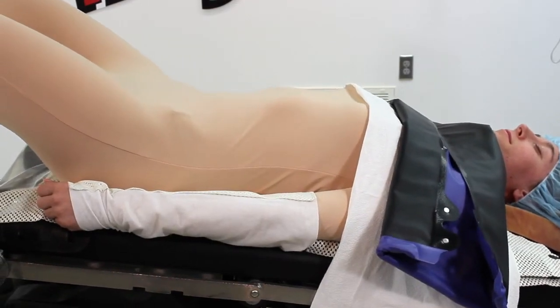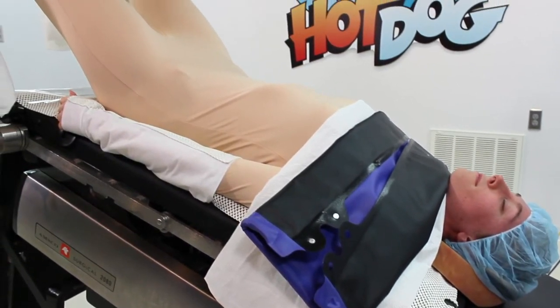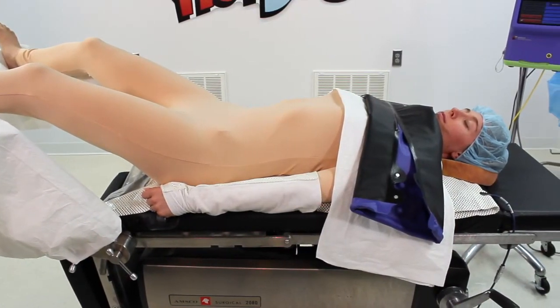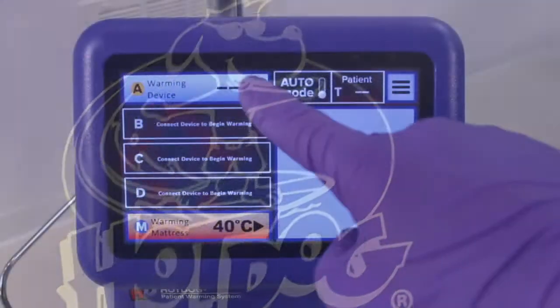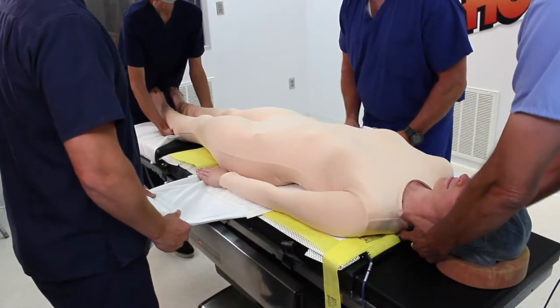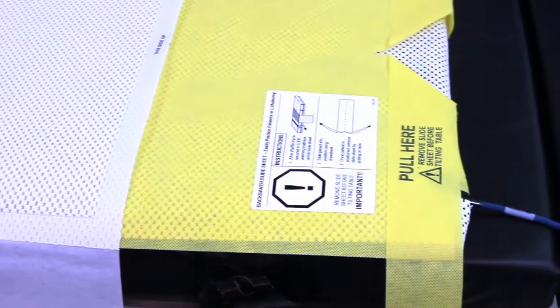The patient can now be positioned securely in steep Trendelenburg to a maximum recommended angle of 40 to 45 degrees. Waffle Grip is used by some of the top robotics programs in the world to confidently stabilize patients in laparoscopic and robotic surgeries. The anti-slip surface evenly distributes friction and mechanical grip to eliminate localized pressure points and shearing forces while meeting AORN recommendations for Trendelenburg positioning. Hot Dog provides conductive, radiant, and infrared heat transfer above and below the patient for better normothermia outcomes. The Backsaver slide sheet eliminates the need to strain when lifting and moving the patient, a common source of staff injuries, thus improving safety and efficiency while saving time, money, and avoiding risk.